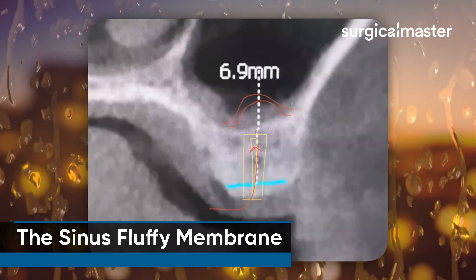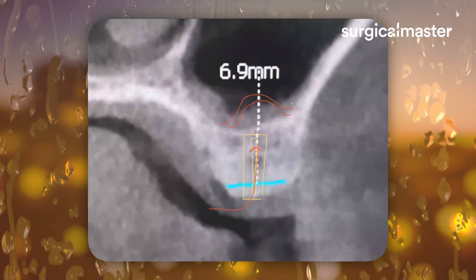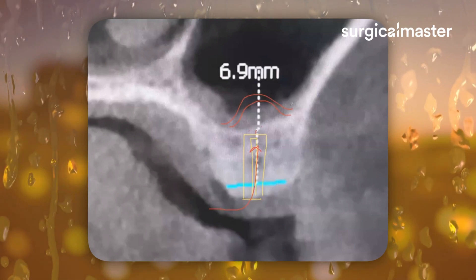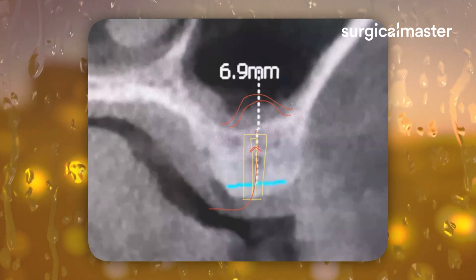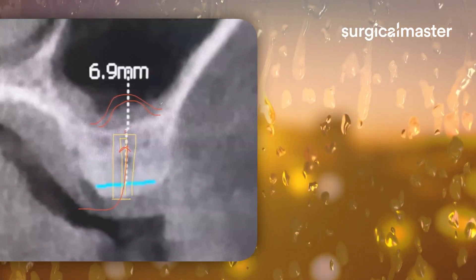Don't over-tap it, because now you know that you've kept the integrity of the membrane. All you need to do is add two more scoops and place your implant. You probably don't have to go to a five because it's the maxilla — it's not the densest bone.